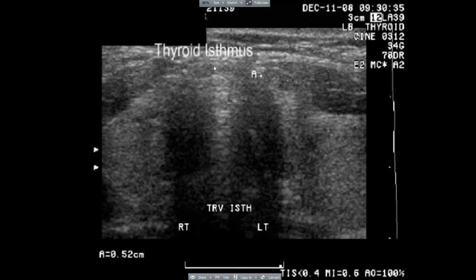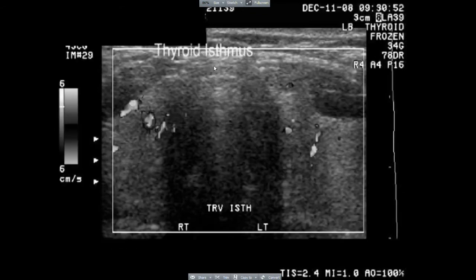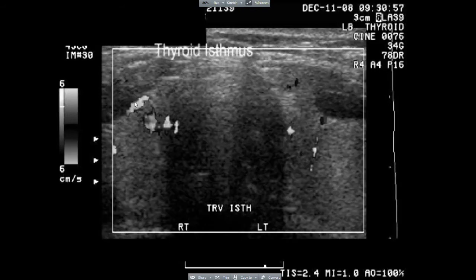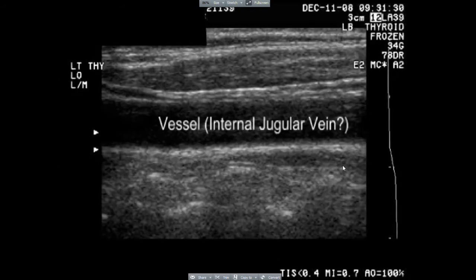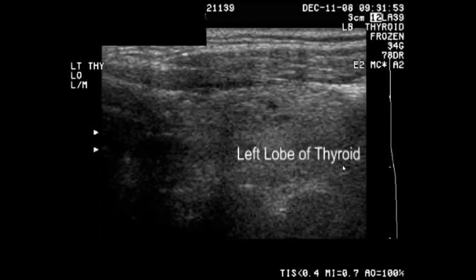Orientation here clearly shows us which side is the right side of the gland and which side is the left. Without compressibility, I'm not sure if this is the jugular vein or the carotid.